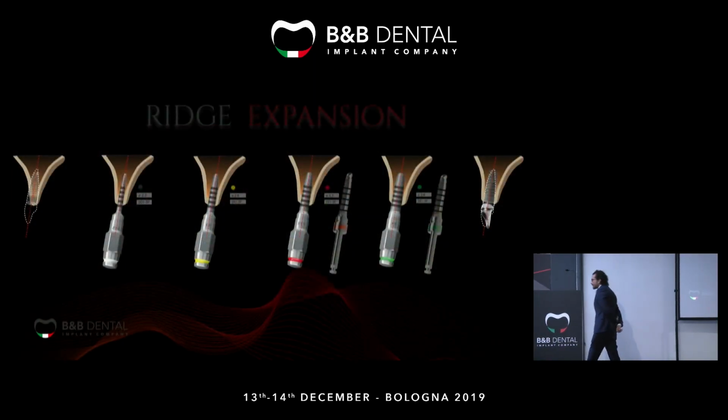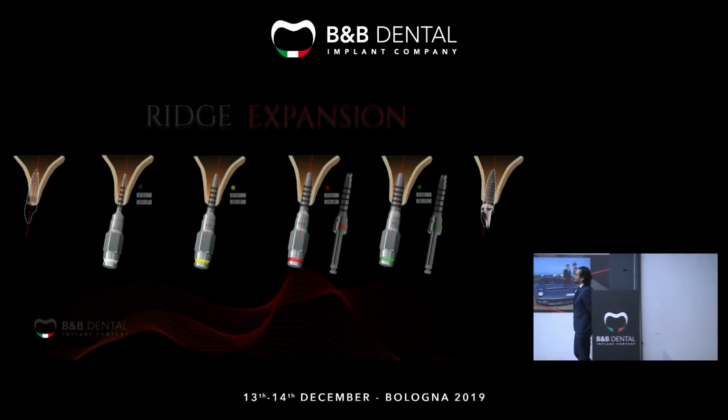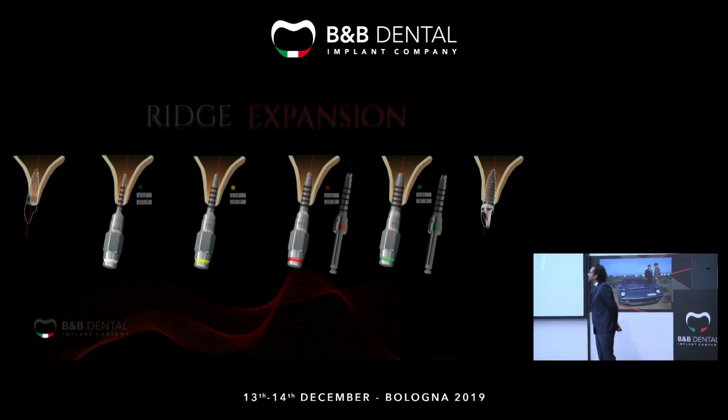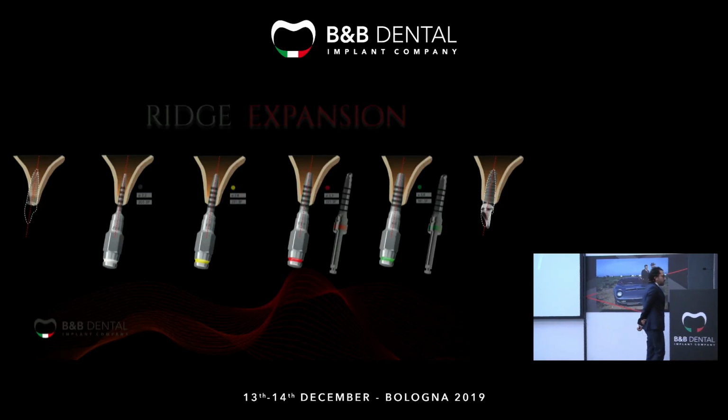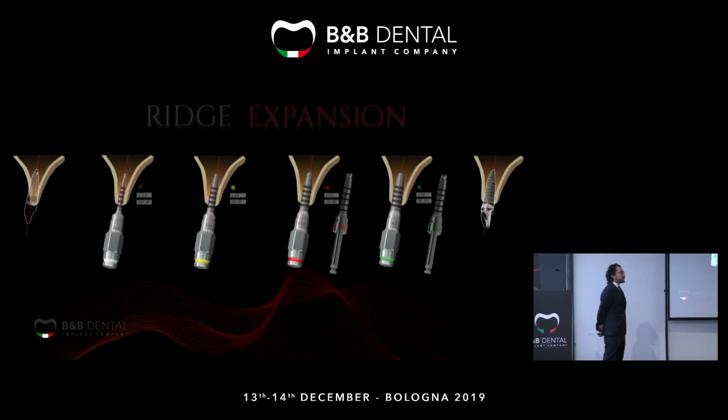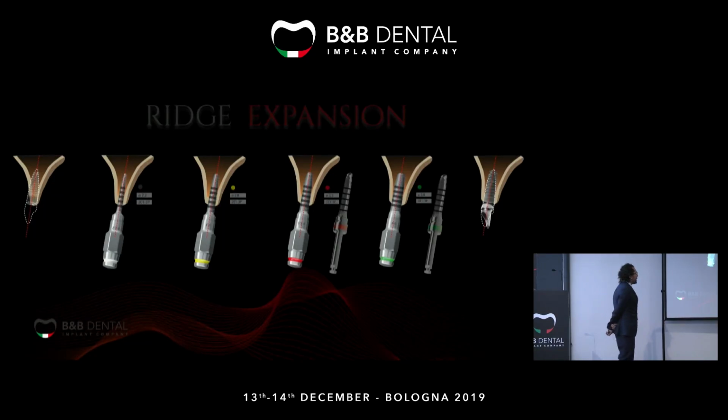Since I started to do implant dentistry, my career is about 20 years, I choose to avoid, when it's possible, to do GBR or use biomaterials. And I wanted to use other techniques, like osteocondensation, split crest, using osteotomes, chisels, and screw-type expanders like this one that you can see in the picture.